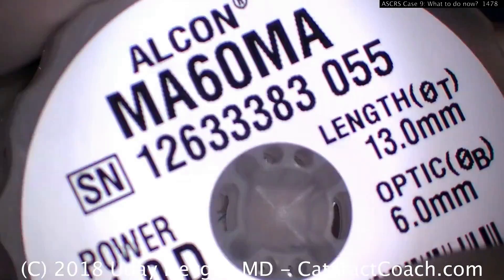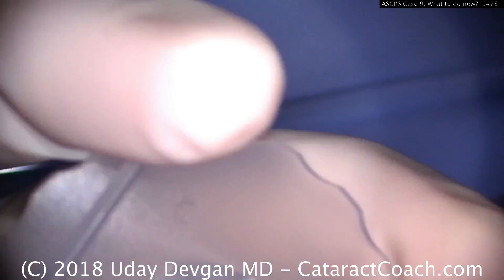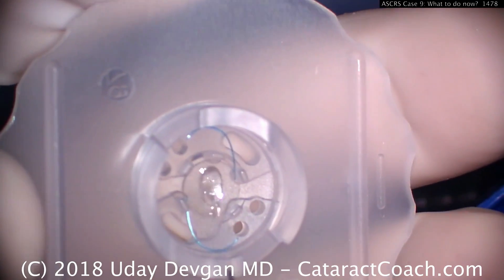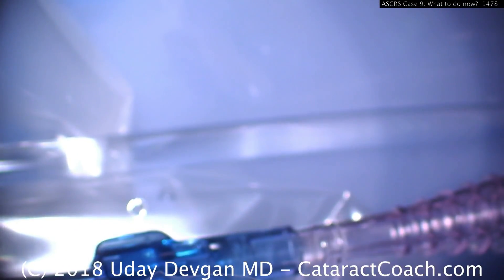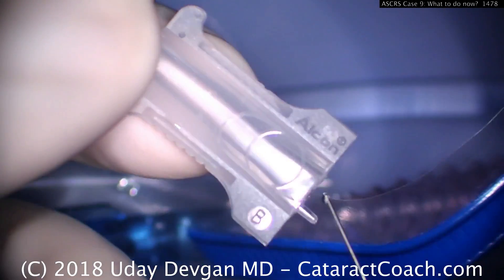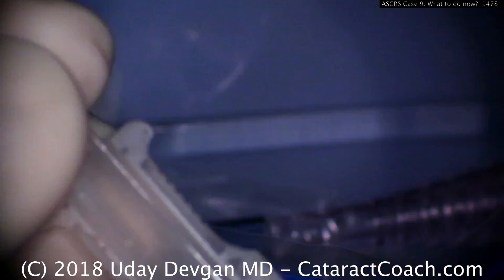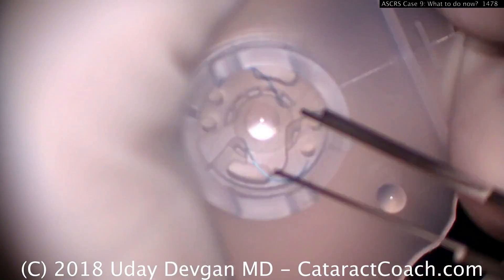Let me show you another important pearl: loading these lenses. This is a one-diopter, three-piece lens, meniscus style. Here's how we load it up. It's important to realize the leading haptic, when you put it in these cartridges, can turn either direction. We'll load this lens and fill up the cartridge with viscoelastic.